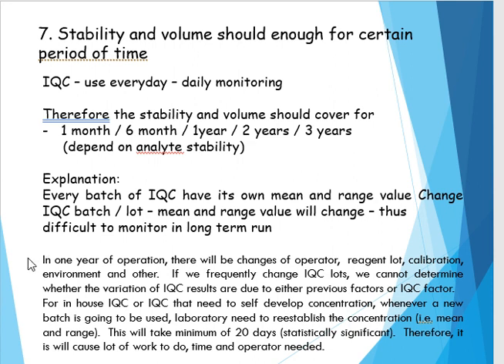Because in 1 year of operation, there will be changes of operator, reagent lot, calibration, environment, and many others. So if we frequently change IQC lot, we cannot determine whether the variation of IQC results is due to the previous factors or the IQC factor. So for in-house IQC or IQC that needs self-developed concentration, whenever a new batch is going to be used, the lab needs to re-establish the concentration, that is mean and range. This will take a minimum of 20 days to be statistically significant. Therefore, it will cause a lot of work, time and operators needed.